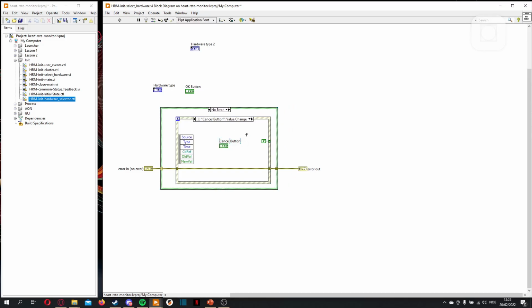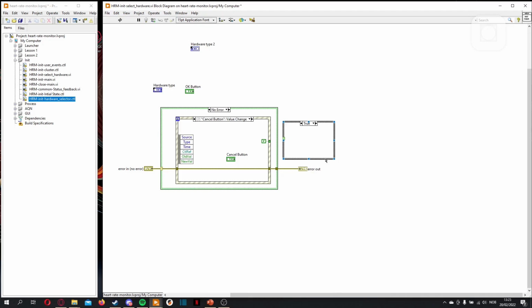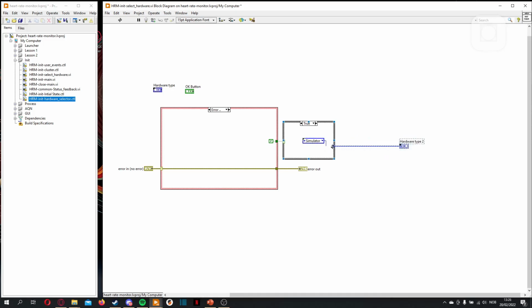I could have just had each of them have their own pipe in here, but I think it's easier to just, like, they could have each their own version of the hardware, like it's simulated in here, puts output, etc. But in my opinion, this is better, because now in the error too, I can add one, which is false. So that when the data comes out here, this is simulated. If for any reason, it's always simulated. And if I wanted another default, then I could change that, because you could say, oh, I always have my DAC here. So then you could have DAC as the default if you cancel or anything. I'll change this to out to make it more apparent what it does.